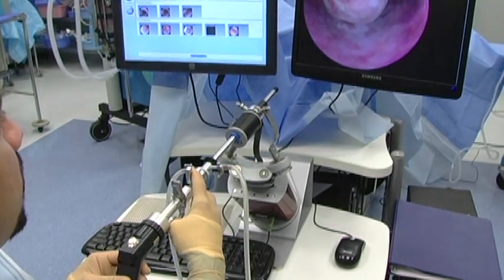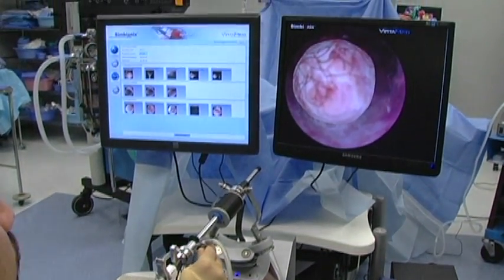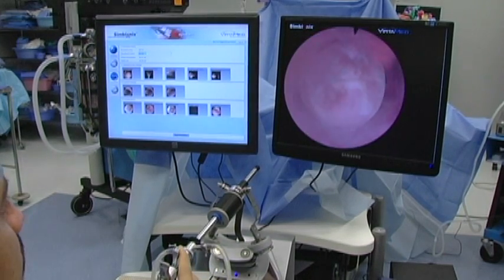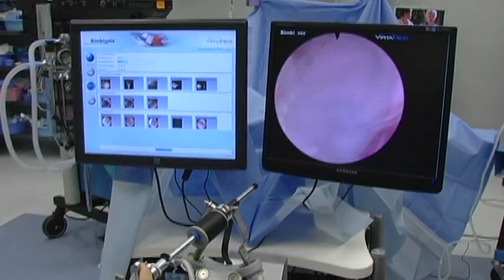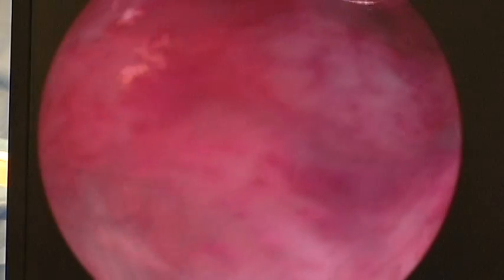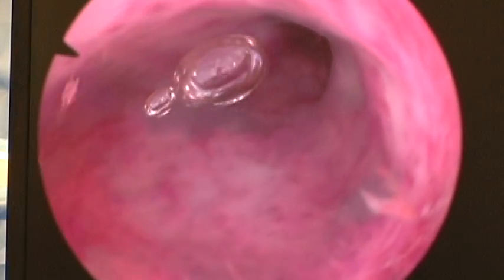Once you're inside the canal, you can visualize the uterine structures. To make sure you're within the cavity, you should be able to visualize the bilateral tubal ostia.